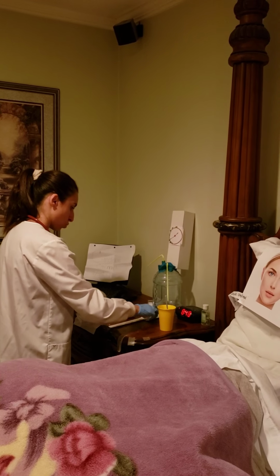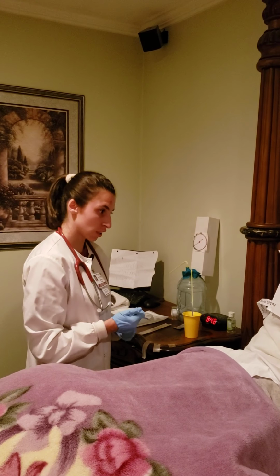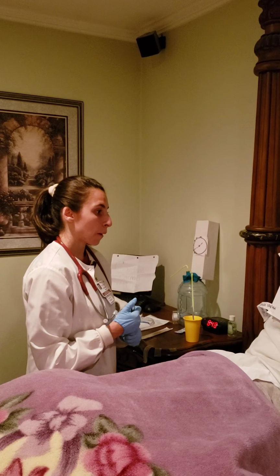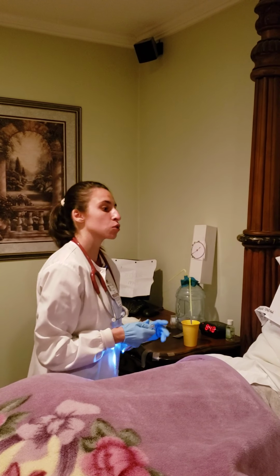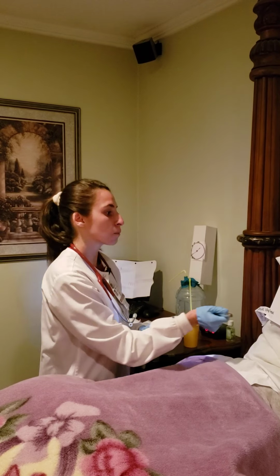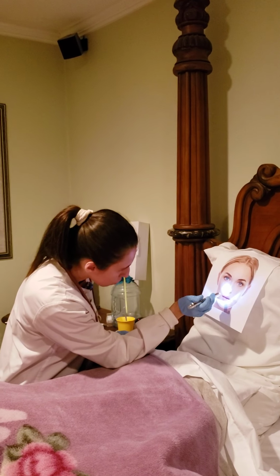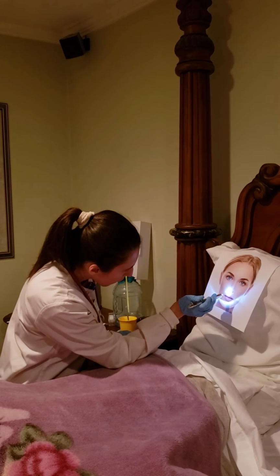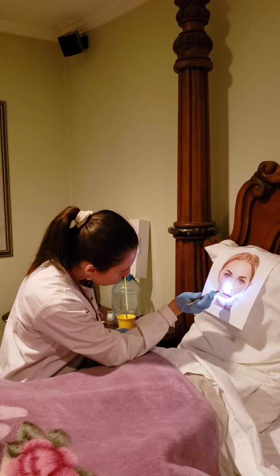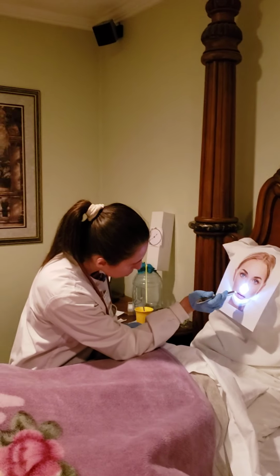I am now going to start doing my pre-assessment checkups. So Ms. Carmel, I'm just going to start doing pre-assessment checkups. So can I have you lift your head up to the ceiling, please? Thank you. So check inside your nostrils. Diverted septum. And while I'm here, have you had any history of nasal surgery or NG tube placement?